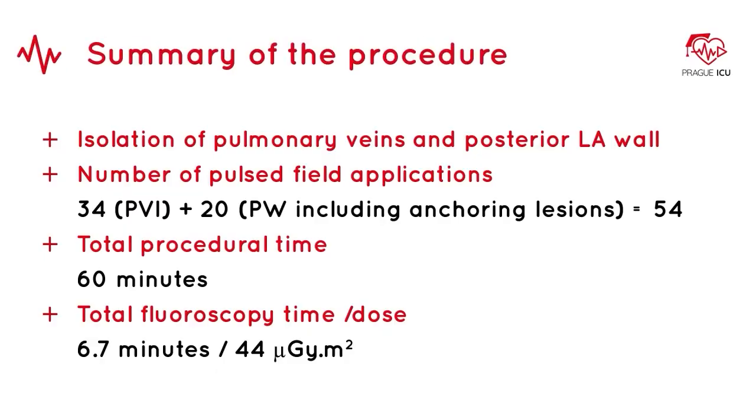This is the procedure summary. We have performed PV isolation and ablation of posterior wall. There were 8 applications per vein, plus 2 bonus lesions. For posterior wall, we have delivered 20 applications of pulsed field energy. Total procedure time was about 1 hour.